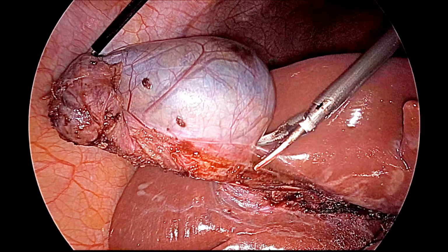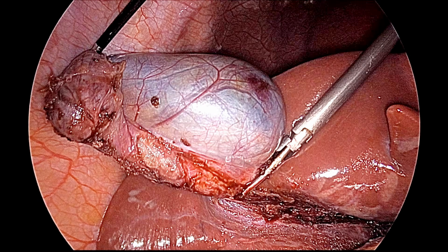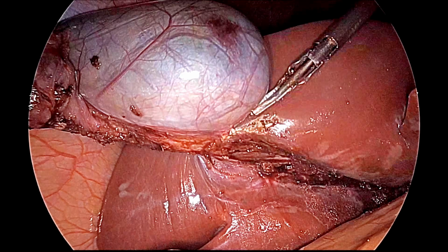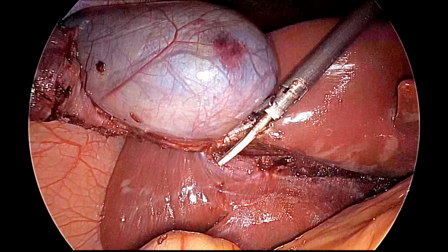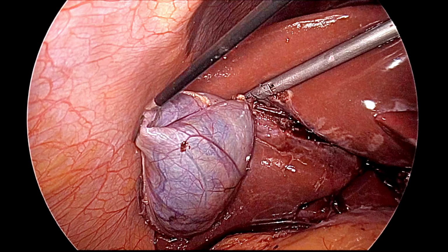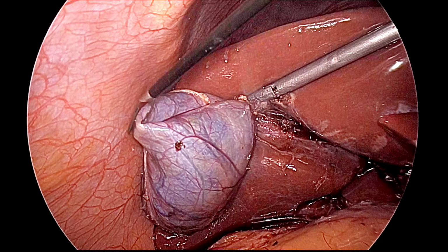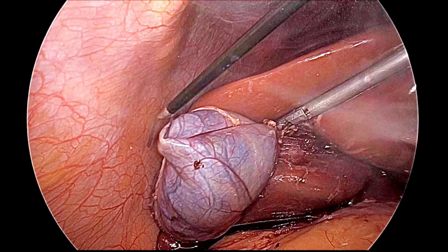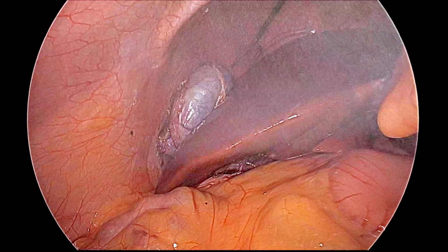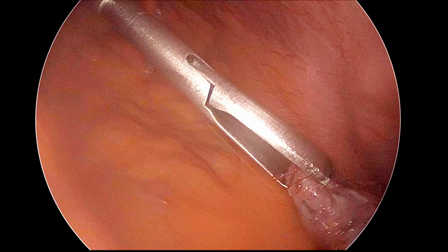So now this is over, just the last part of the fundus attachment of the gallbladder to the liver is there, that is also getting separated. Now, because we have only one 10 mm port that is in the umbilicus, we will take the gallbladder out through the umbilicus, and for that you need a 5 mm telescope, and claw forceps will be introduced through the umbilicus and it will be pulled out.